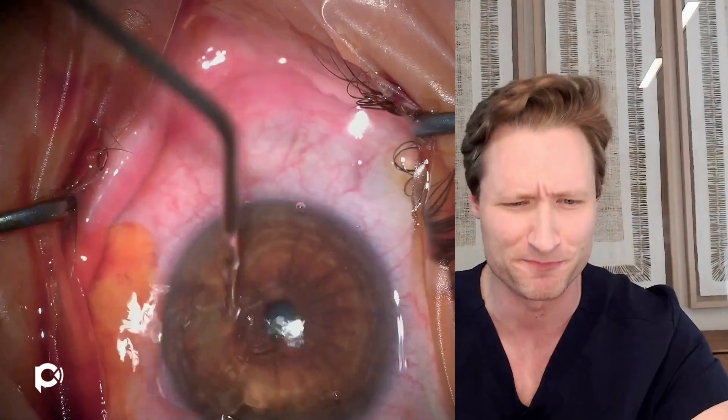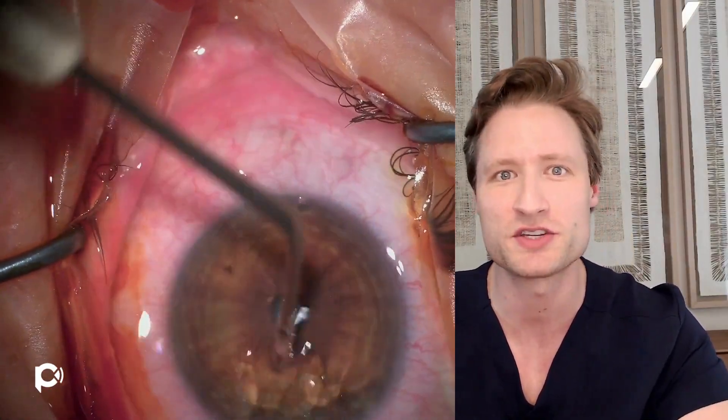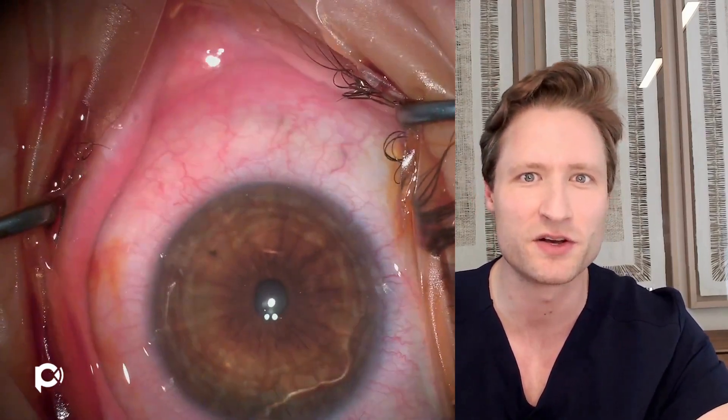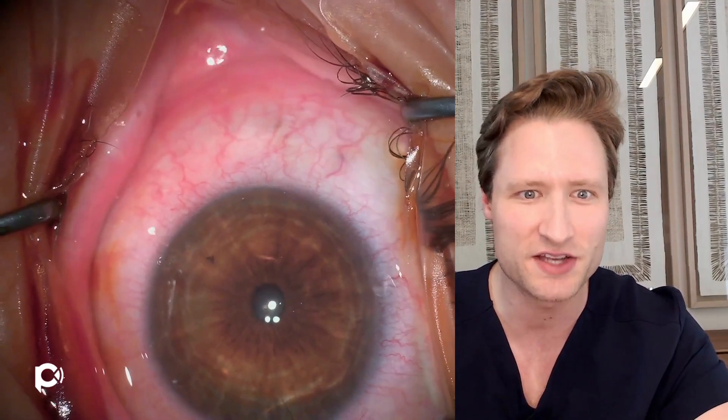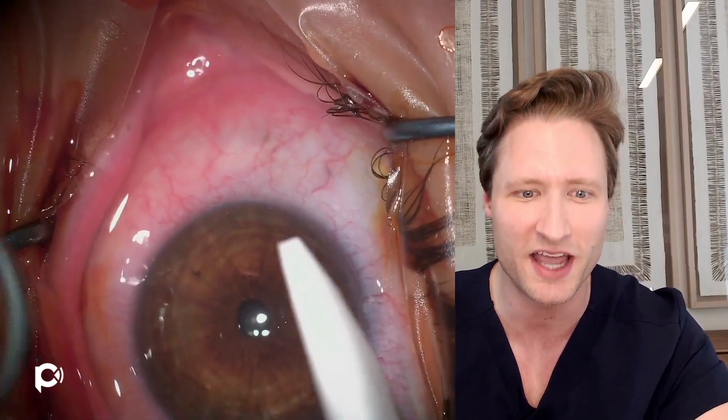We ourselves have been doing CARES now for probably four years or so. I'd like to share just another routine, run-of-the-mill case that perhaps will give people interested in starting with the technique a little encouragement that it can be done. The operation CARES we do very comfortably just under topical anesthesia in our office, basically on a weekly basis. This eye has just had topical tetracaine anesthesia supplemented with a little lidocaine gel.